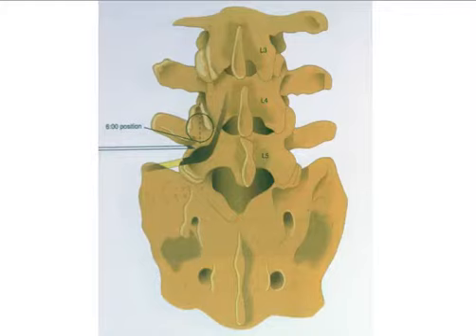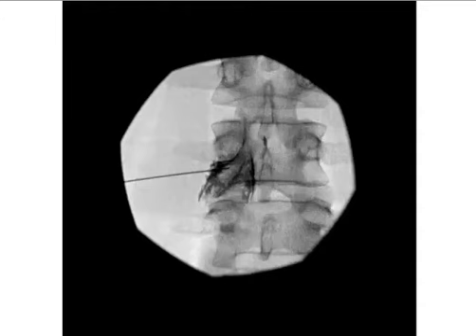You always want to go on the intervertebral, so you find the spinous process, and then you go right in between the spinous process and just go lateral, about an inch lateral. And if you go straight into that, you'll hit that facet joint. You'll be right on top of it, and then you can infuse the stem cells right around there.